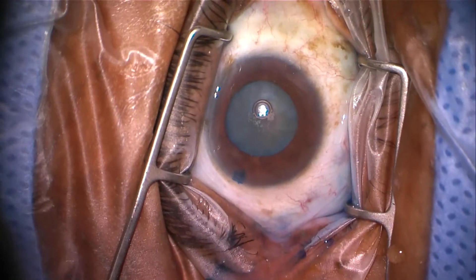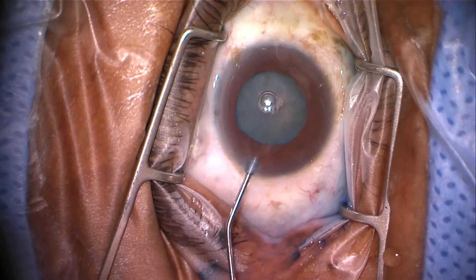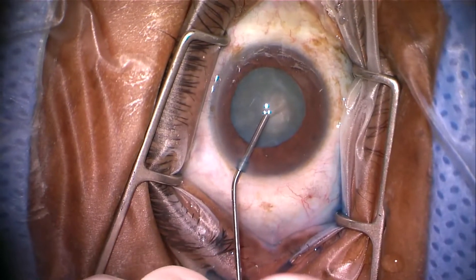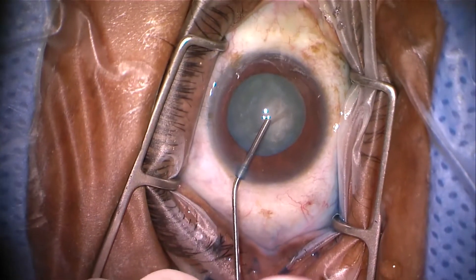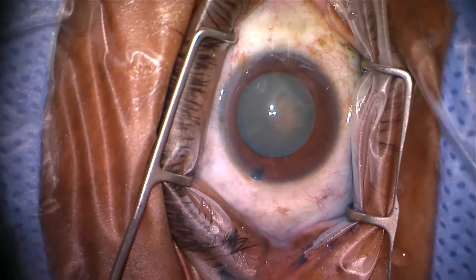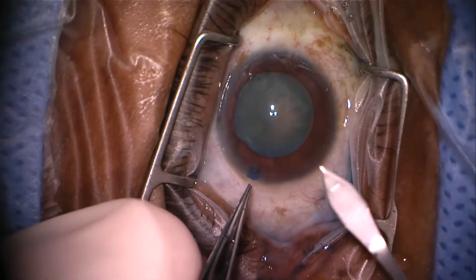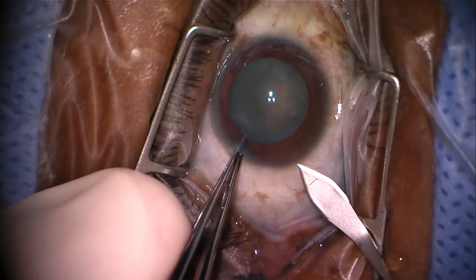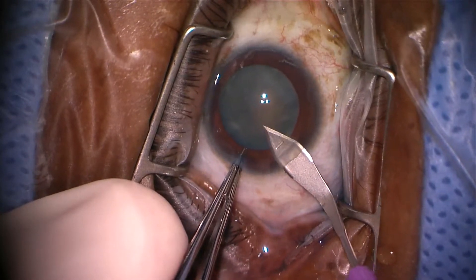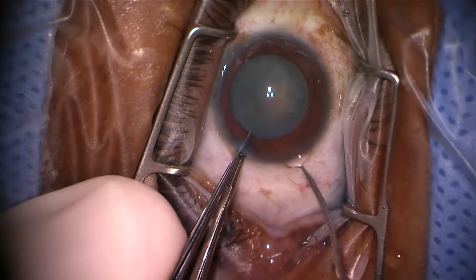Next we're going to get the viscoelastic product and flatten the surface of the lens. What you should notice is that the surface of the lens flattens — see it bowing posteriorly there? That's how you know that the capsule or the lens bag itself is not very tight. A tight bag will be prone to the Argentinian flag syndrome. When I use the viscoelastic, I'm really paying attention to see whether it seems tight. If it's tight, you would prepare for it by evacuating some of the fluid, maybe with a needle beforehand.